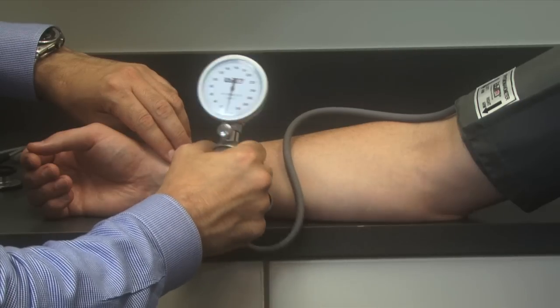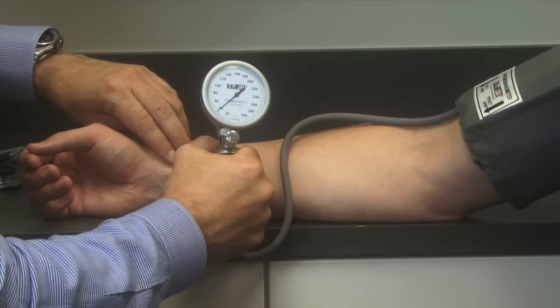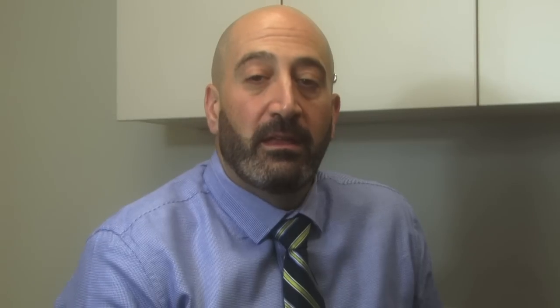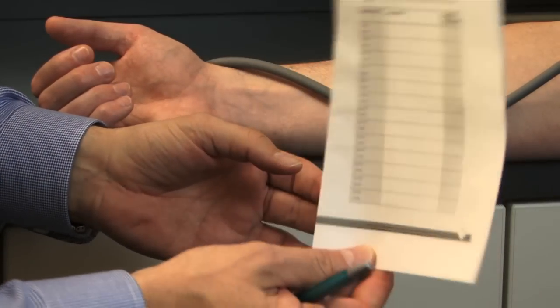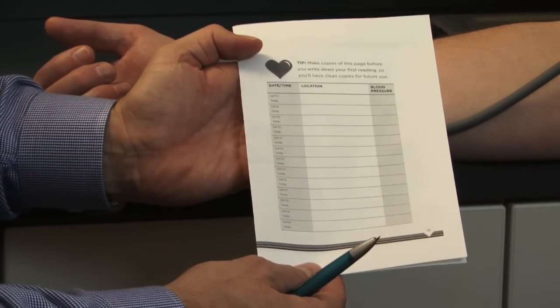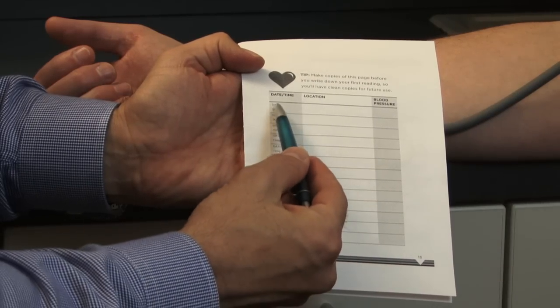The proper blood pressure measurement for this patient today was 130 over 80. That's considered acceptable since it is less than the general goal of less than 140 over 90, which applies for most patients. The last step is to correctly document the value. The Million Hearts website provides diaries for this purpose. Whether using a diary or another piece of paper, it is important to record the date, the time, and the location.